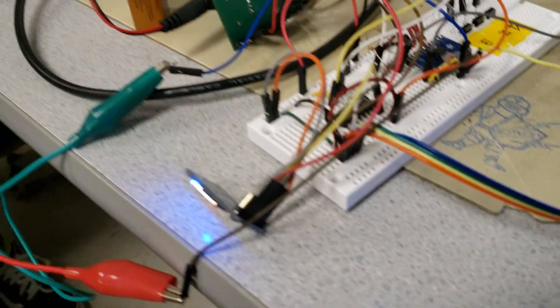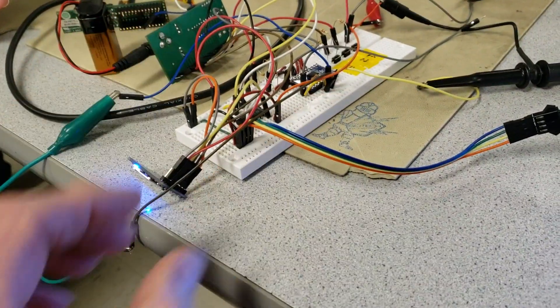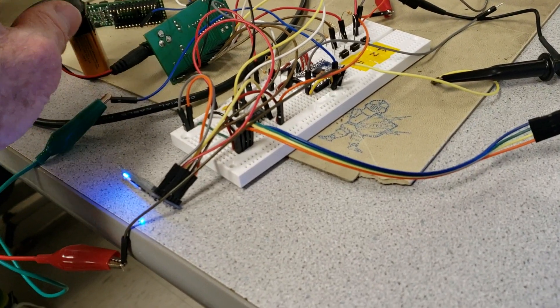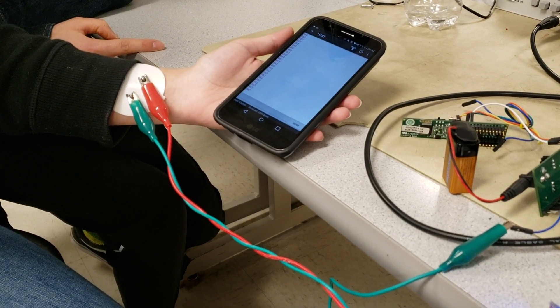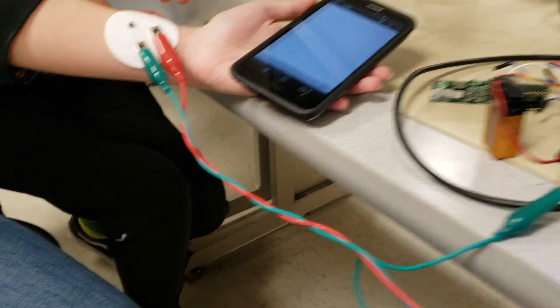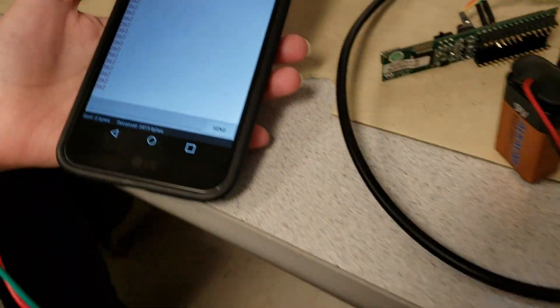Even though this is currently spread out across a board, it could all be compressed into a fairly small volume. It's all battery powered right now, except for the LEDs which are drawing a tremendous amount of power. This is wired to your wrist to get the impedance, which is currently sitting at about 360 ohms.